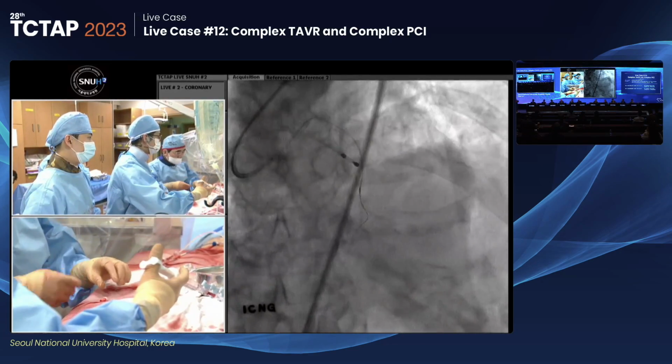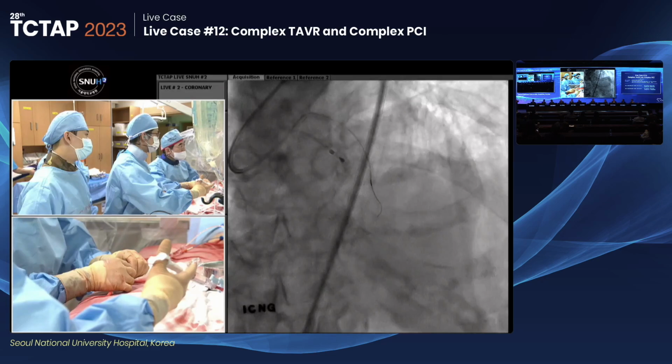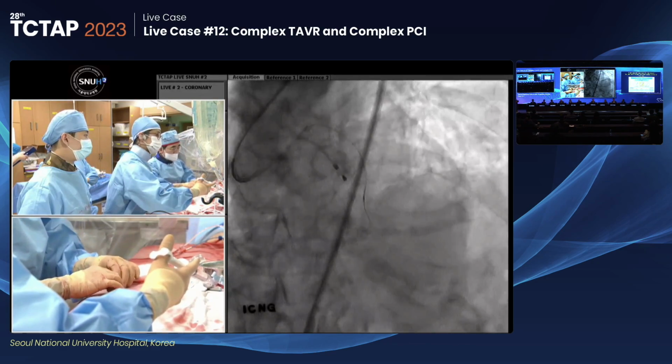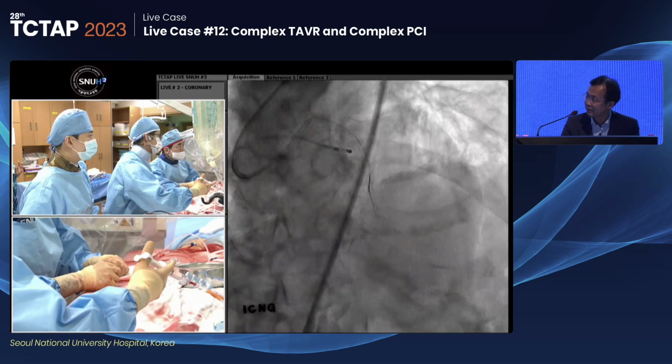Do you have drug-coated balloon in Korea? Drug-coated balloon for Shockwave is not yet available. I heard in Japan it is available. No, the drug-coated balloon for the right. Yeah, DCB for the right is available. Okay, that might also be a choice if the stents won't go. It may also be tough to deliver.